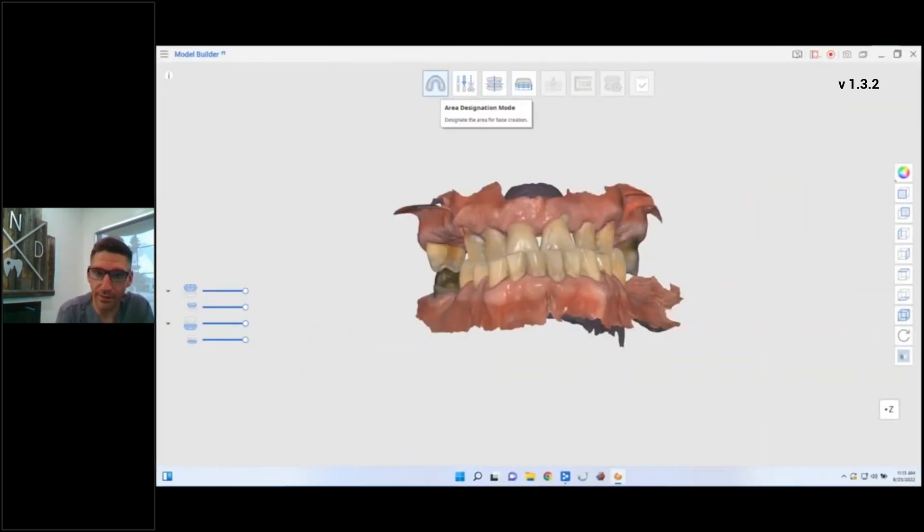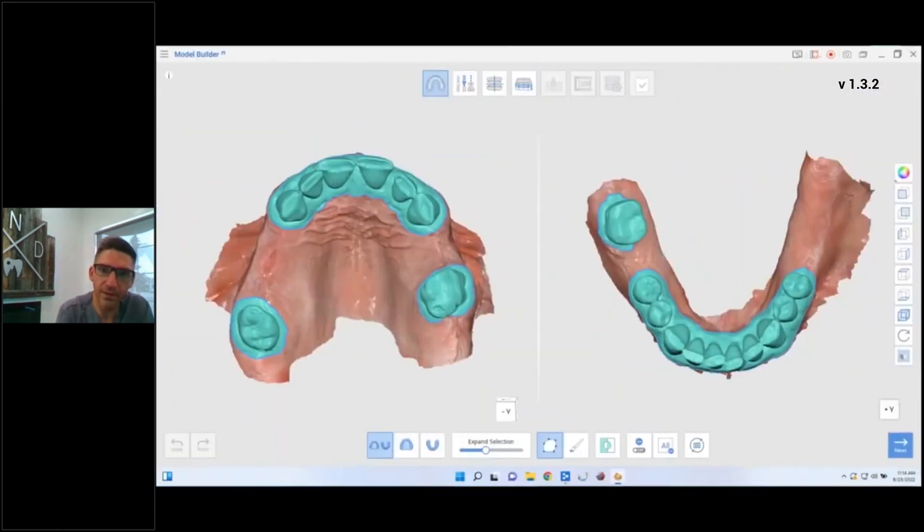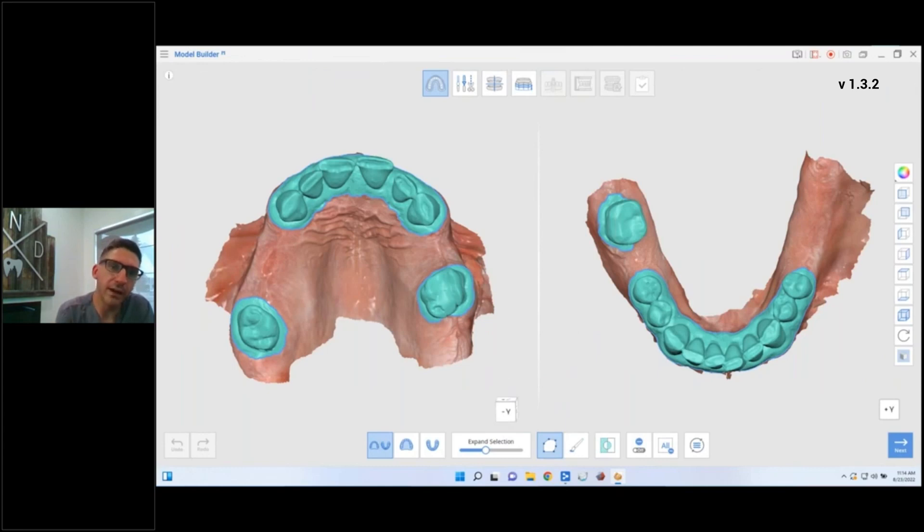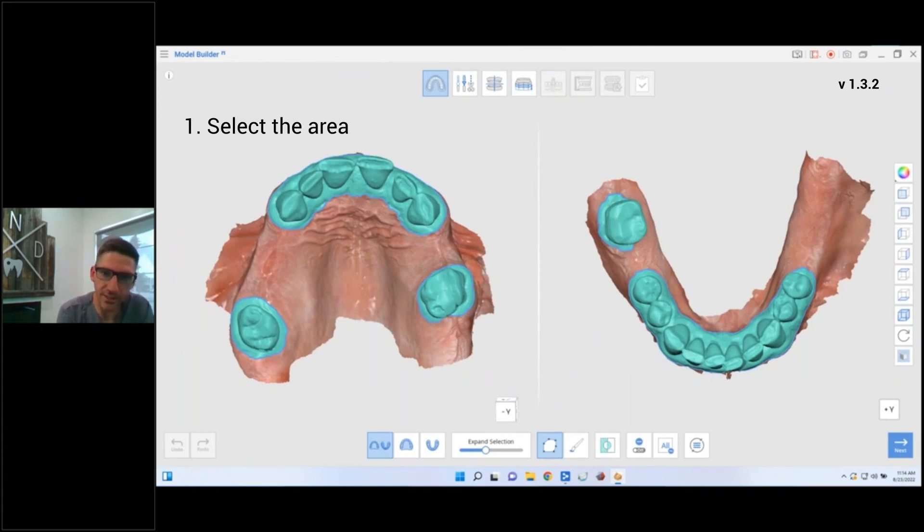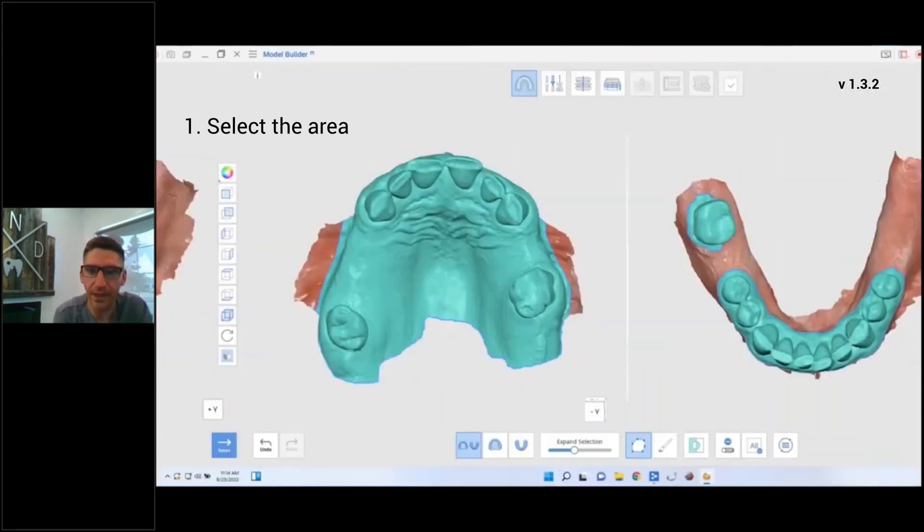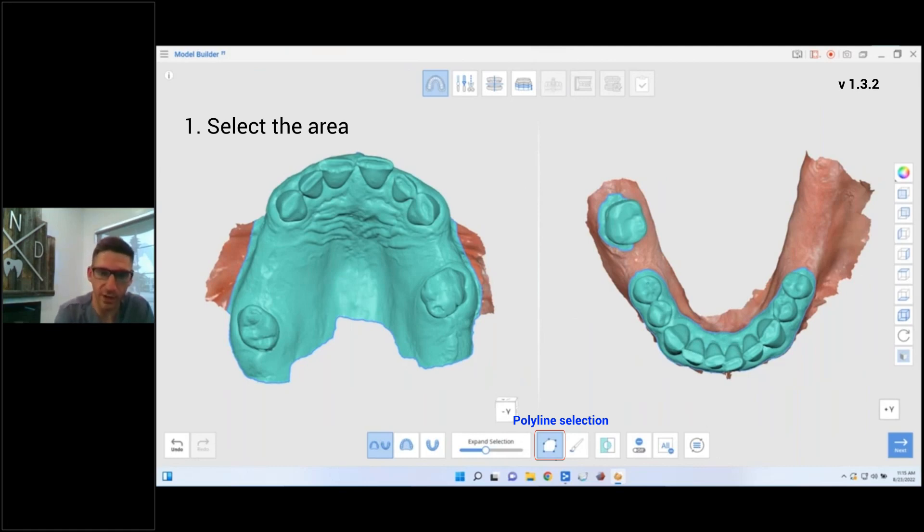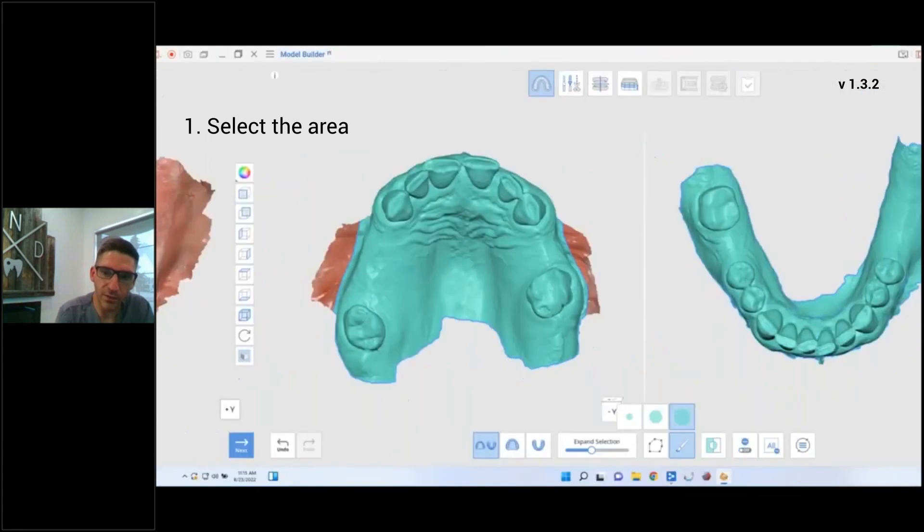First thing we're going to do, select the area for the base. Medit auto-selects the teeth only. Again, when we're doing partial dentures we need more than just the teeth. That would be perfect if you're making aligners, something like that. So I like to use the dot and line tool.